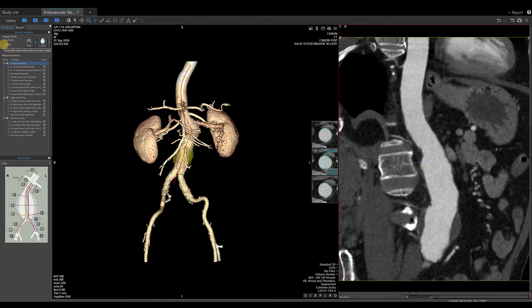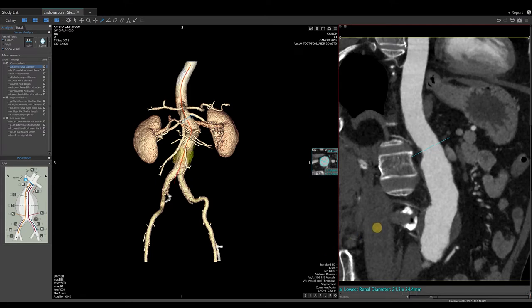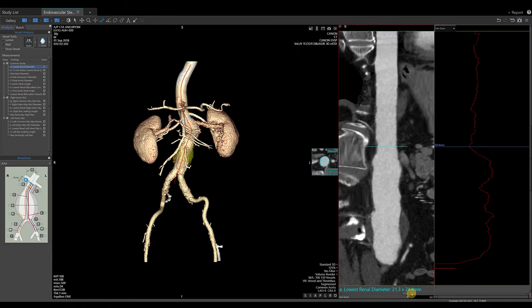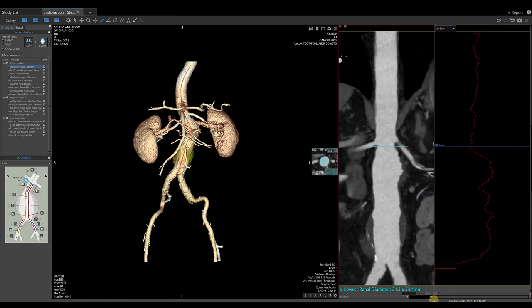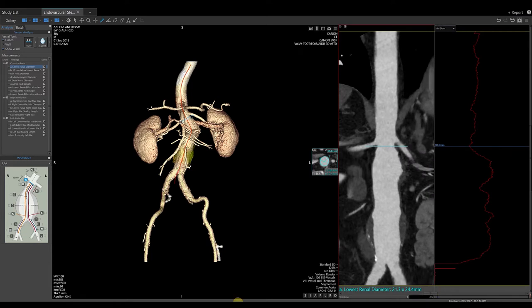Turn off the wall once again. On the worksheet, select the first measurement, lowest renal diameter. To better demonstrate whether the right or left renal artery is the lower of the two, in the bottom right-hand corner of our CPR image, select the red slash to change to a straightened or lengthened view. Use your slide bar to rotate around the image. After the renal arteries are located, roll the mouse wheel to move a hidden dark blue line to the desired location.